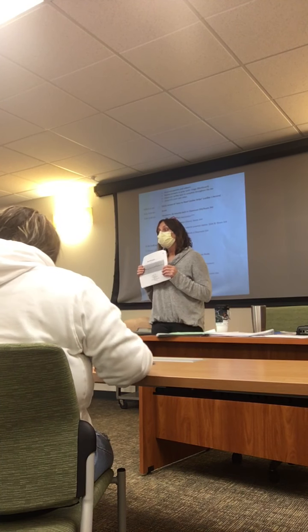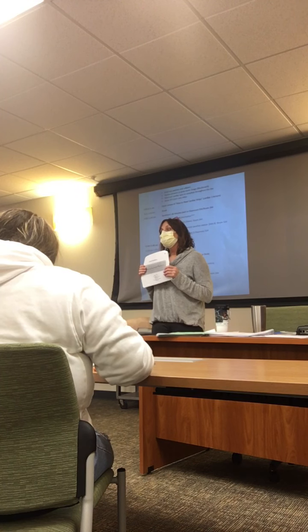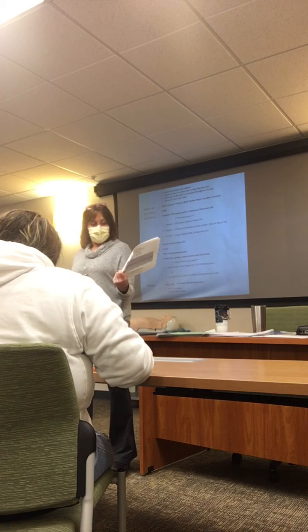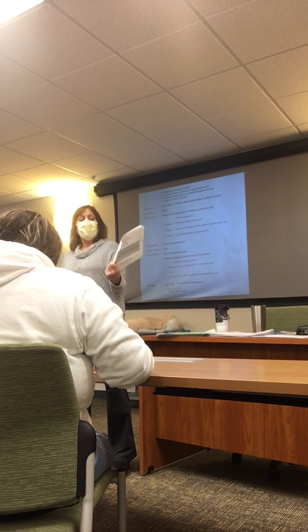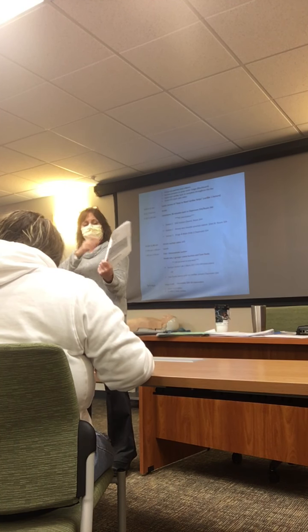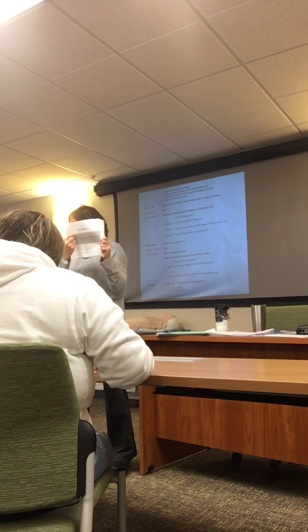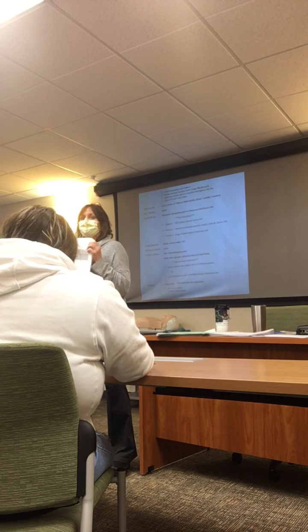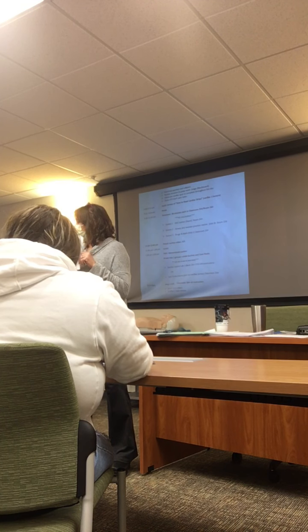Yeah. Would you call this one quadrigeminy too? Right? Because it's missing, looks like maybe every fourth one. Is that how that works? No, not really, because it would be a different looking beat. These are just irregular beats. Okay. There's just kind of a longer pause after that. Yeah. Any other questions about atrial fib?